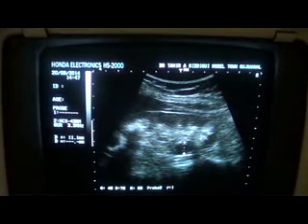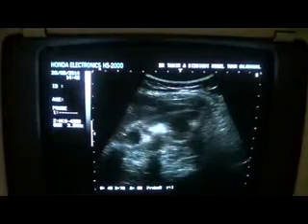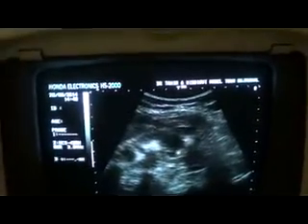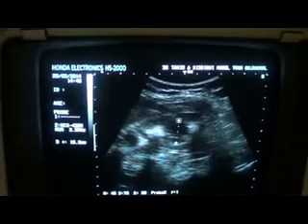A few others, smaller ones, are seen at the lower pole, measuring approximately 11 into 11.4 millimeters. One of these is seen in the anterior medullary region. Don't confuse this area with the medullary pyramid.